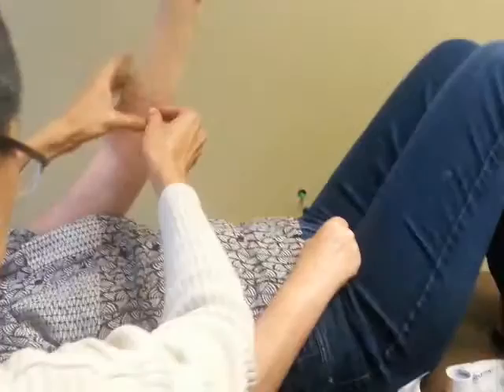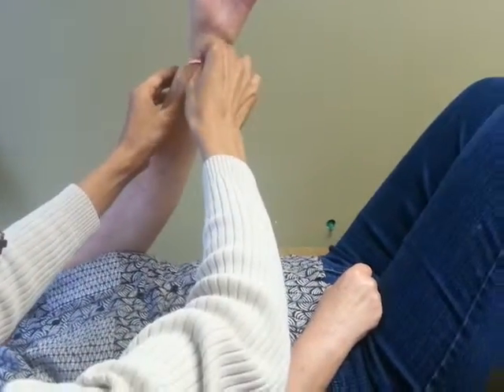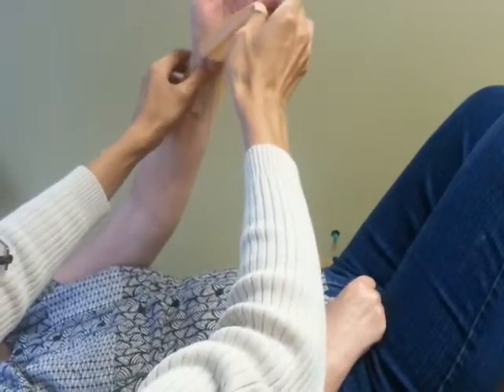This is going to actually pull tissue towards this way. I started up here, so it's going to go the opposite direction — it could actually make it worse. So I'm going to take it off. I gave a demonstration on it so you can see how to do it.